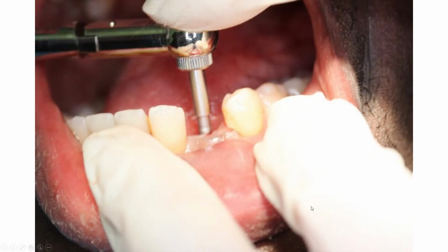There's two lines on the driver itself. The first line works out at about 2 millimeters from the top of the implant to that line, and the next line is at about 3 millimeters from the head of the implant to the top of that line. And what you do is you start to insert that implant.